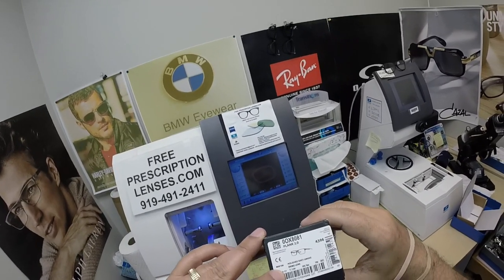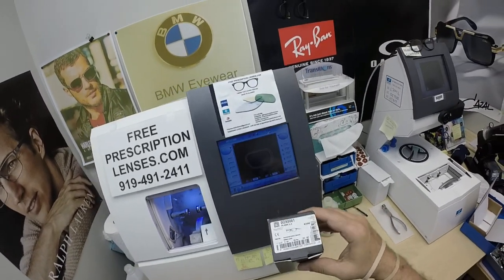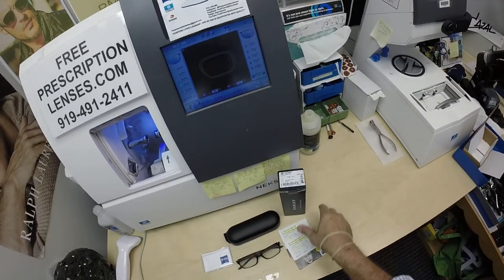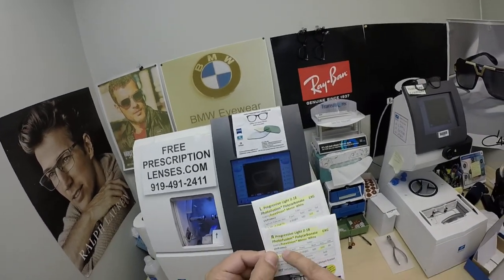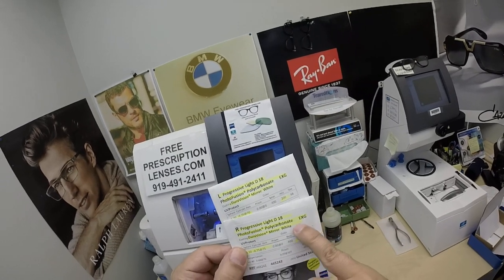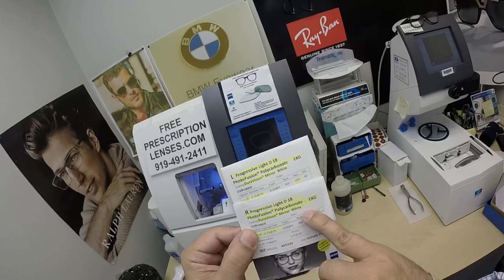He got color size 51, and color 06, which is the polished gray smoke. He got the Zeiss Light D digital free-form progressive lenses with the Zeiss Photofusion Extra Gray in the Duravision Mirror White, which I call the Silver Flash Mirror.